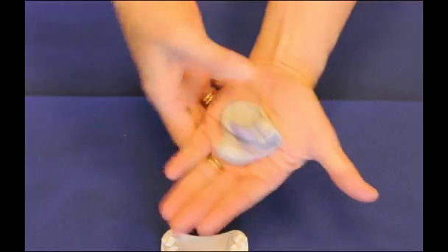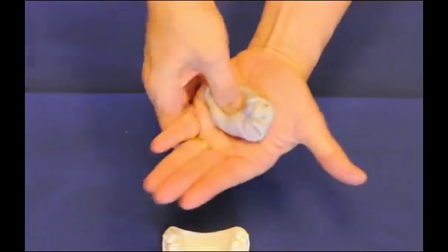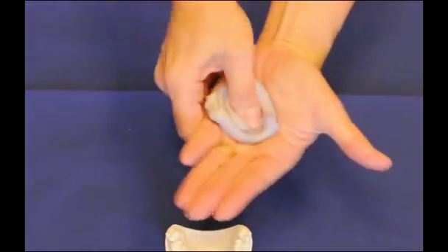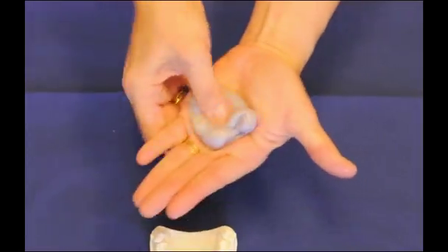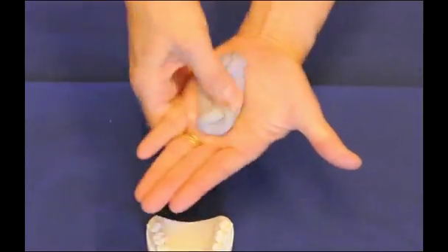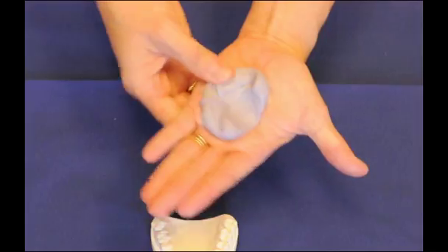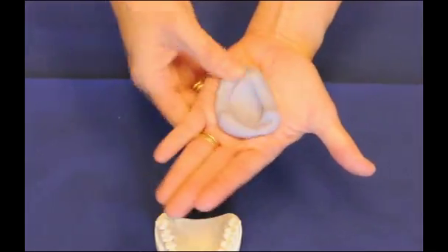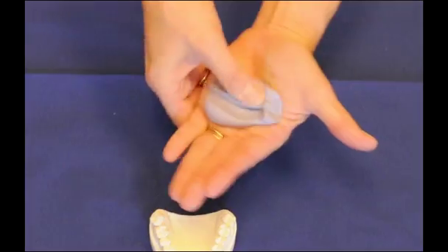You'll notice I'm mixing in the palm of my hand and kneading with my thumb from my other hand. What I'm looking for is to make sure that the gray and purple colors are being evenly incorporated, so that when I'm done mixing, I have one uniform color, and I no longer have any streaks of gray and purple.